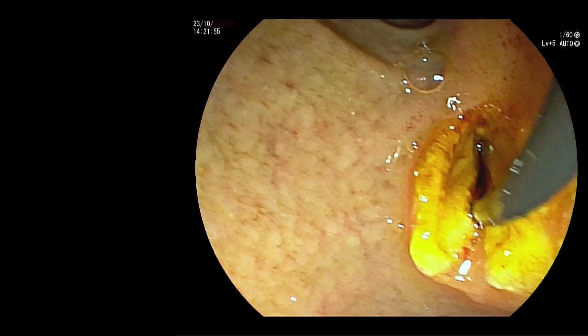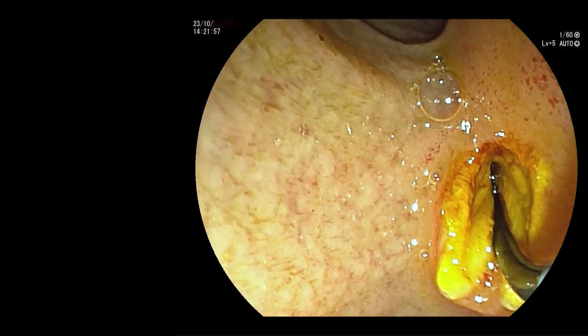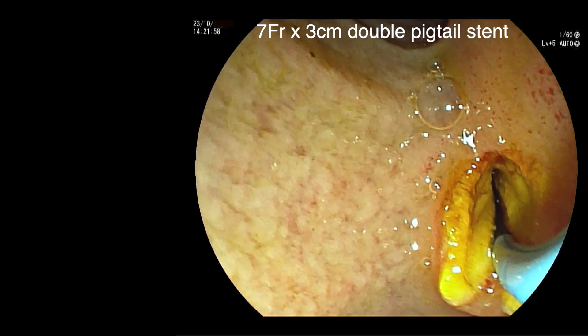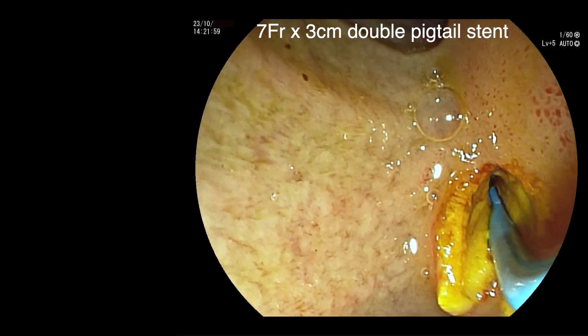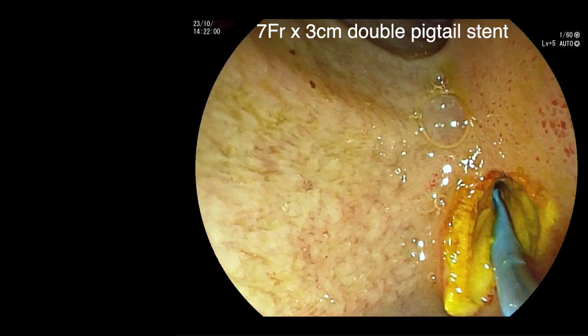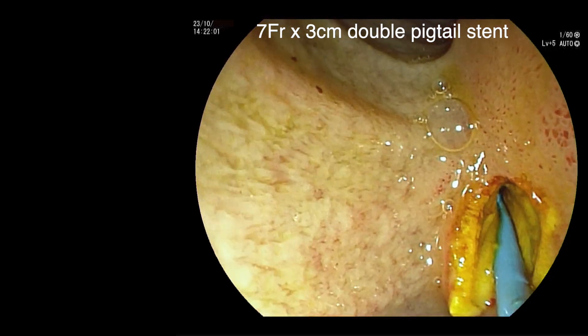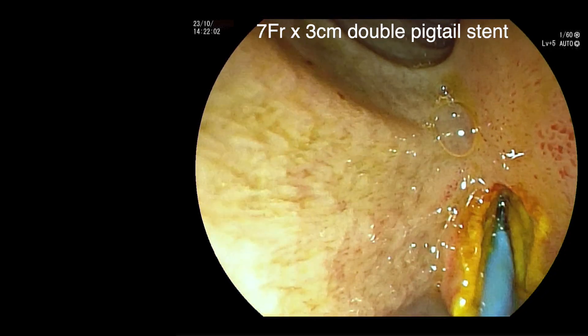Finally, a 7 French by 3 centimetre double pigtail stent is inserted into the bile duct.